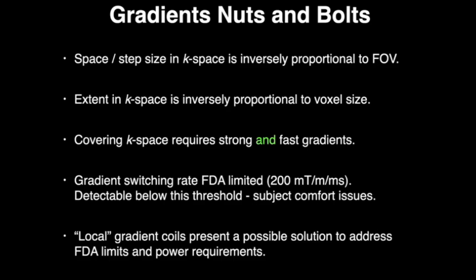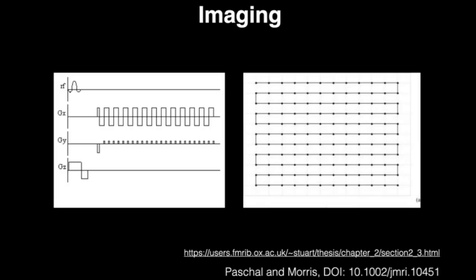Okay, so let me explain why this could be useful for us. As we're acquiring data here, we want to traverse K-space, but it turns out making these jumps from one line to another and changing the direction of walking through K-space tends to be very expensive in time and energy. On this graph here, this is an idealized graph. These look like they don't cost any time.